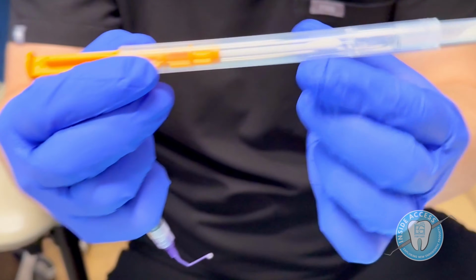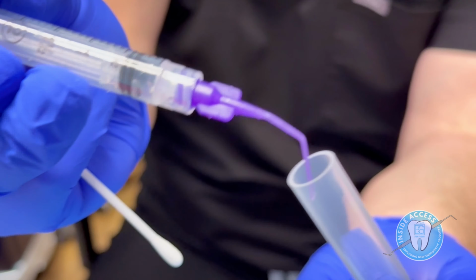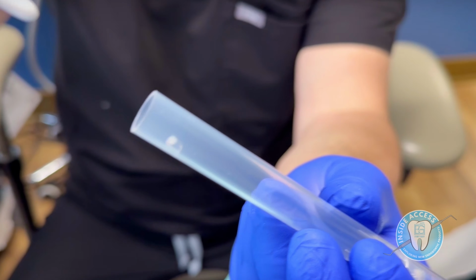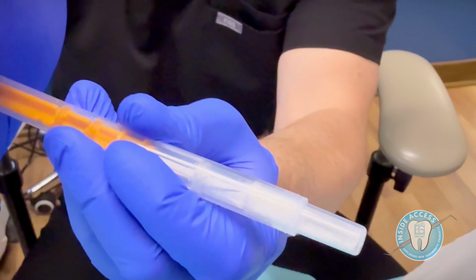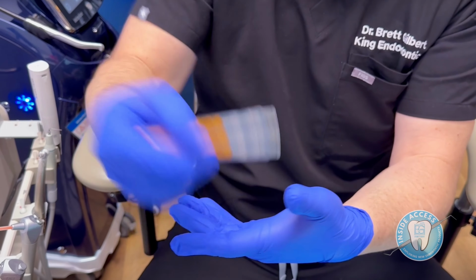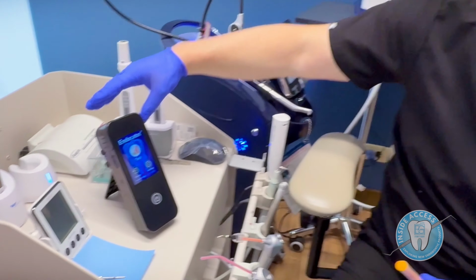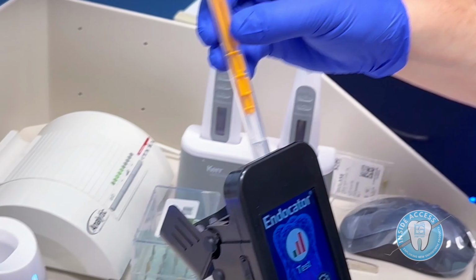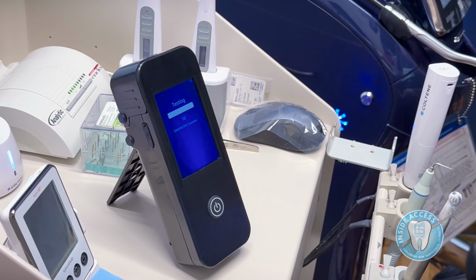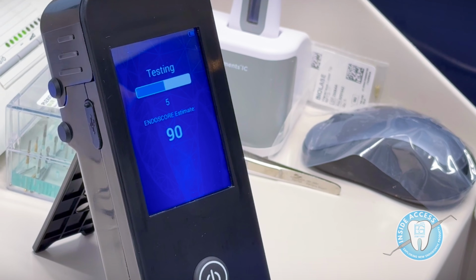Then it has these little testers. I'm going to place just a few drops of the solution inside the tester, just like you see there. Then I'll take the swab and carry it down and bring it together. Now it's going to react with a little material in here, an enzyme that will allow the machine to read if there's any ATP. So you can see the Endocator is ready to go. I'm going to lift the lid, place the tube inside, and press test. You'll see it gives a little estimate immediately, and it only takes 10 seconds for the reading to come up.